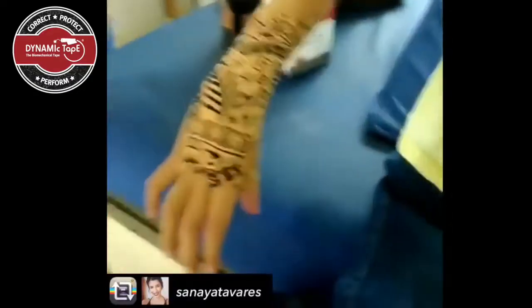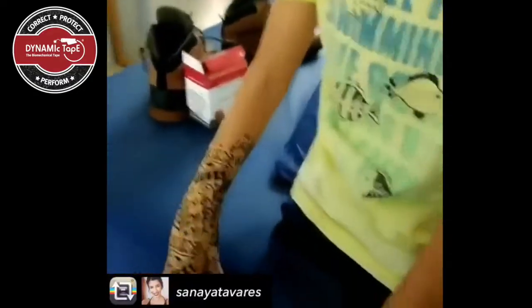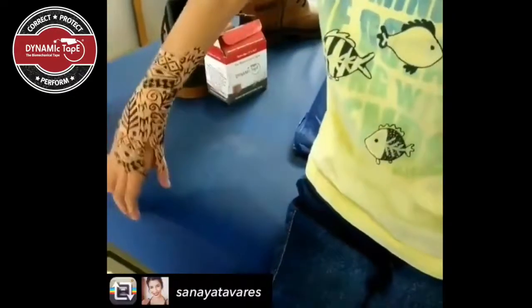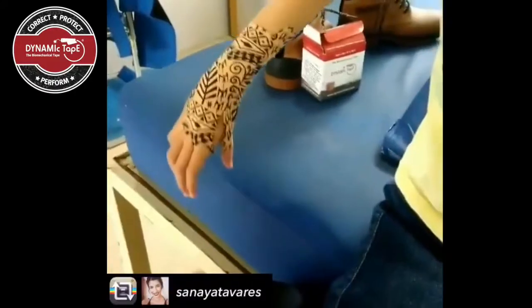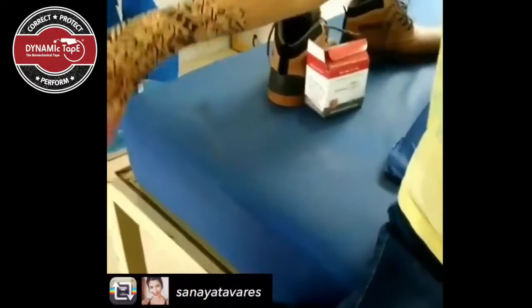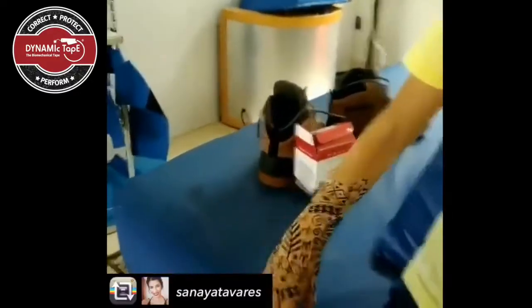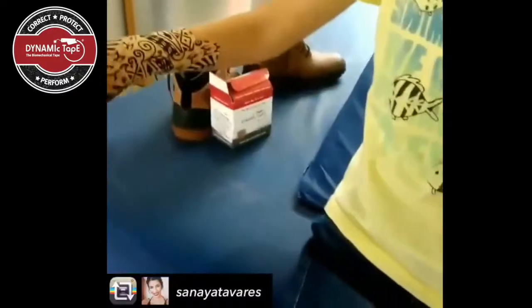With a simple light tape job to get that thumb repositioned out and a bit of wrist extension, we can see now that we can get the weight down through — breaking that dominant pattern. We can actually get some elbow flexion and more of a functional grasp starting to appear as well.